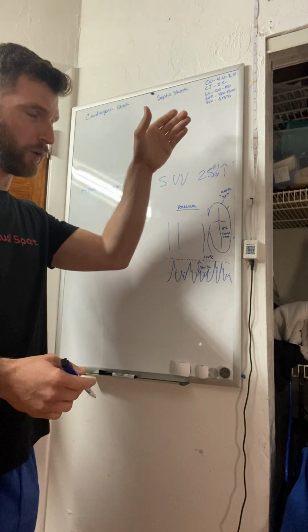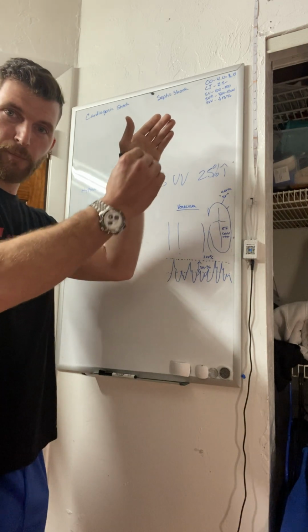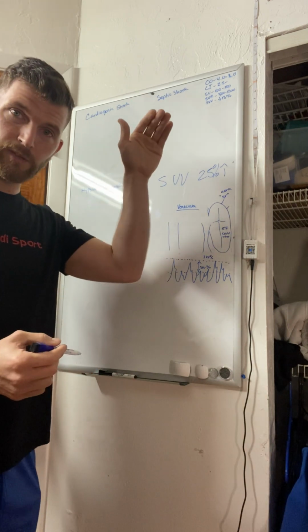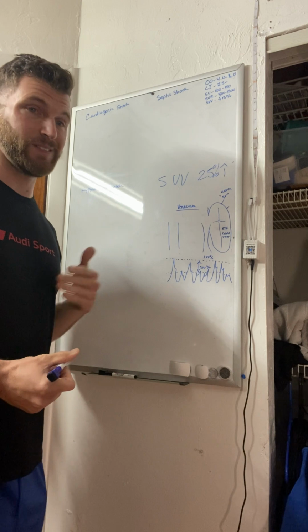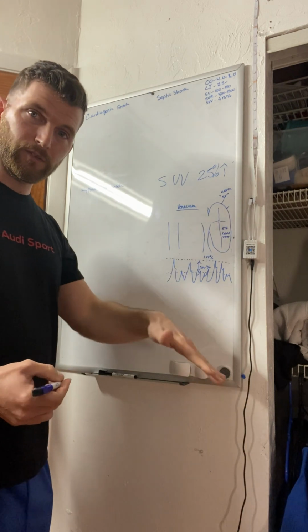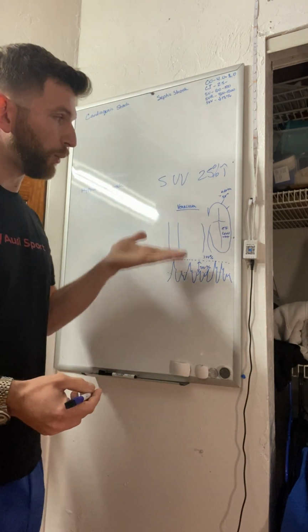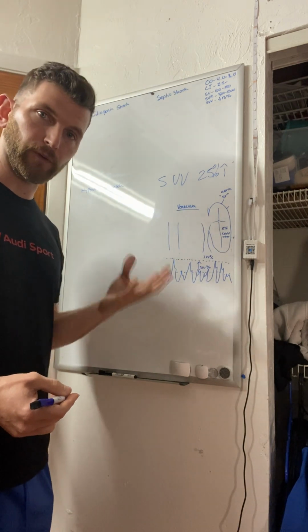You held them there for 30 seconds to a minute, and you see their stroke volume creep up a significant amount. Let's say it goes from 40 to 60. Okay, that's a positive sign that somebody is dehydrated, right? That means that you're actually pouring venous fluid back in, right? You're pouring that blood back in from the legs into the core, and it's helping the preload of the heart, and the heart starts to get a better stroke volume, okay?